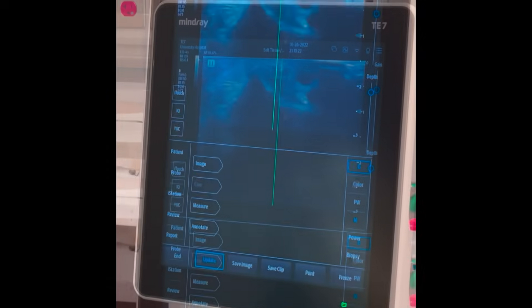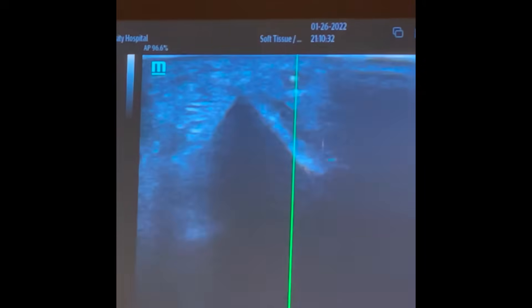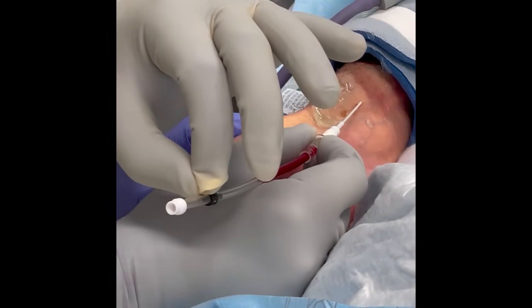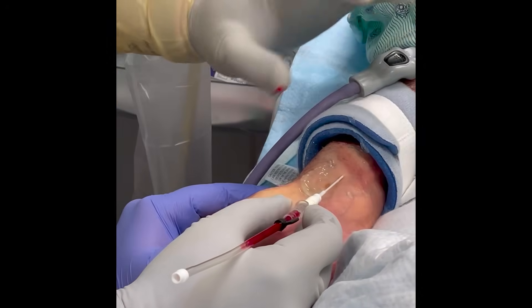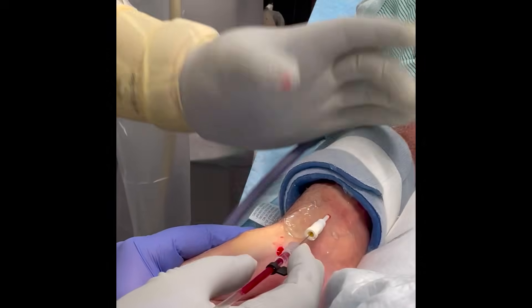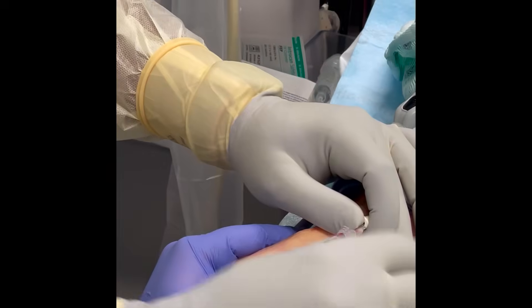You can see me tenting up against the vessel. It looks like I'm inside the vessel — do you see that little white thing inside on the screen? I like to walk it inside the vessel and advance it on the screen a little bit. You can see this is filling up with blood now. Without moving your hand, advance your guidewire all the way into the vessel, stabilize your needle, and advance only the catheter into the artery. We are in, and we can see blood coming out. That's how you do an ultrasound-guided arterial catheter.